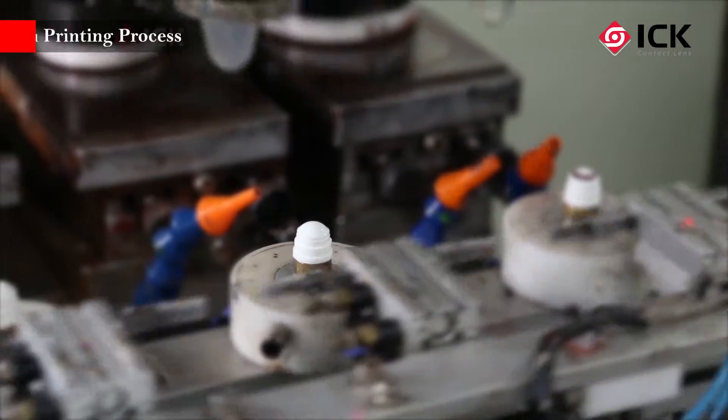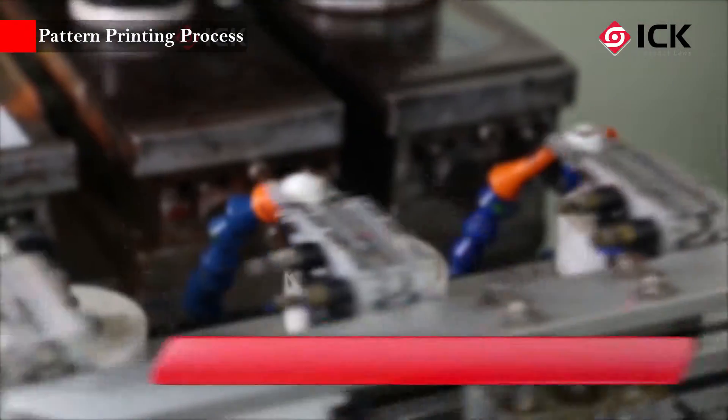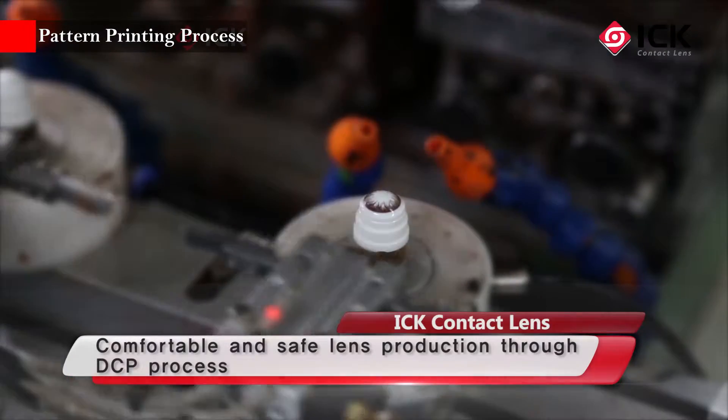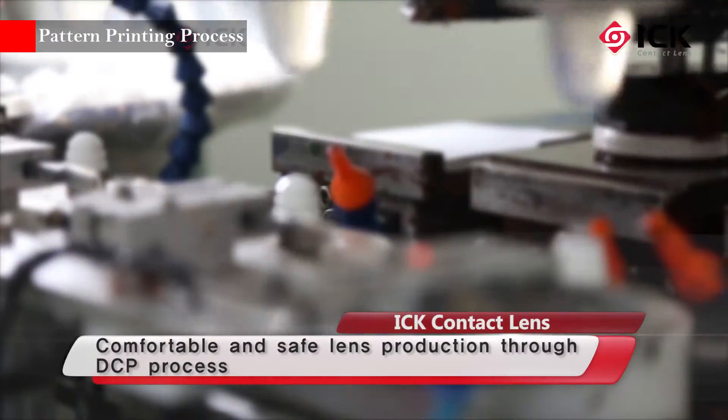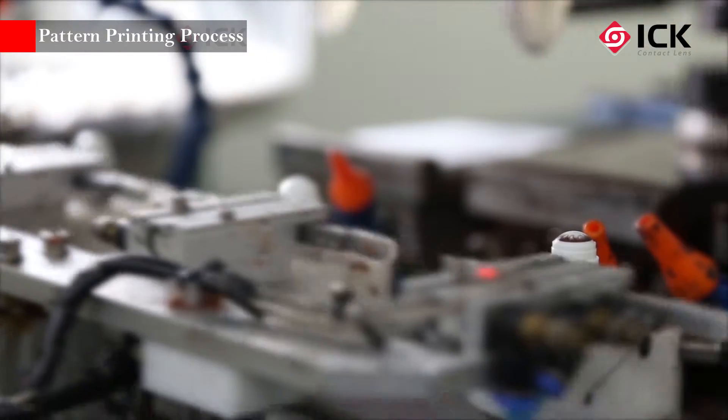In addition, ICK's DCP method prints a pigment between contact lens material and keeps the pigment from coming in direct contact with the eye, providing comfortable and safe color contact lenses.